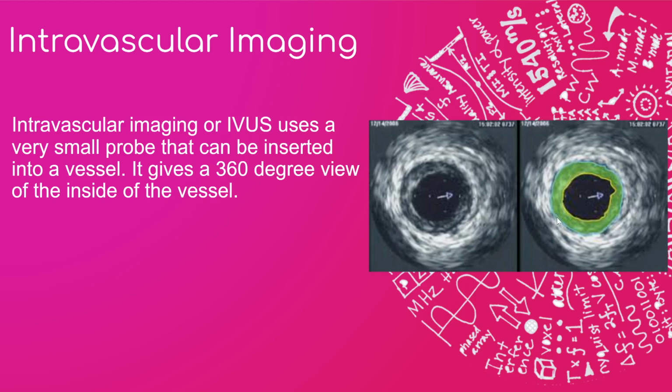So IVUS is typically used to evaluate cardiac arteries right now. I believe that's where it's been used most. It doesn't use any sort of x-ray like catheterization does, and that's typically how they've been looking at heart vessels. They put a dye in and then they use x-ray to see how that dye fills in the heart vessels. Well, now they can go in with ultrasound, no x-ray, no dye, and actually see and measure the extent of stenosis within the vessels. So kind of another cool tool that is out there.